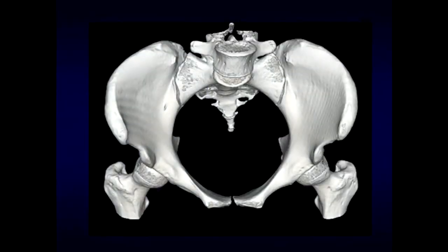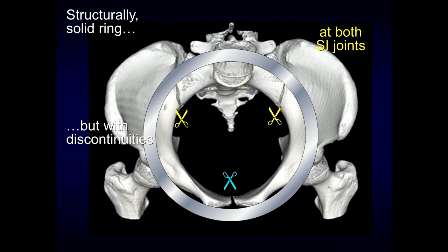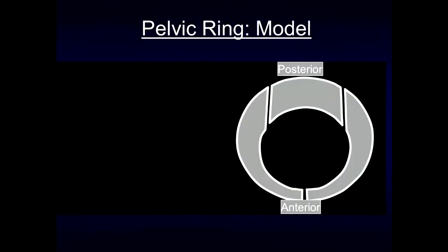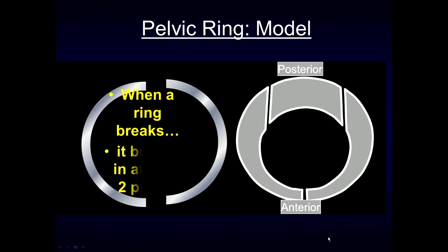Looking at a CT 3D image, we can see the normal solid ring structure of the pelvis, with discontinuities at both the sacroiliac joints and at the pubic symphysis. Using a pelvic ring model, if you get a break in one location, it's very common that it's going to break in at least two places. You can get an isolated ramus fracture, but whenever you see one break, go ahead and look for that second break.